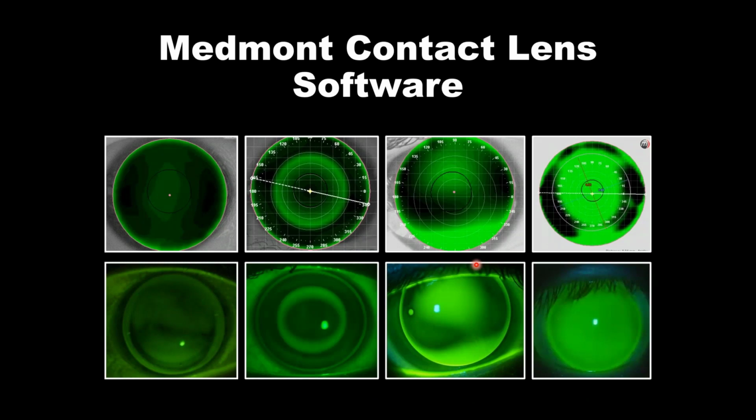Now, we didn't talk at all about the contact lens software, or we really touched on it very little. Really, this is one of those areas that if you have a Medmont, you want to learn a little bit more about it. We at Pacific University use the contact lens software to fit 100% of our corneal GPs. We want to model the fitting of the lens in this theoretical environment before we place the lens on eye.